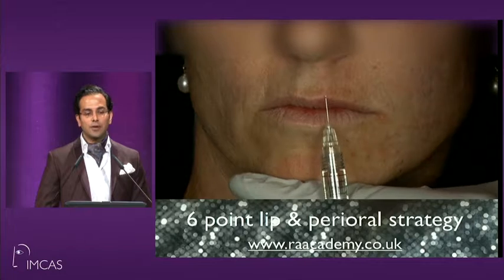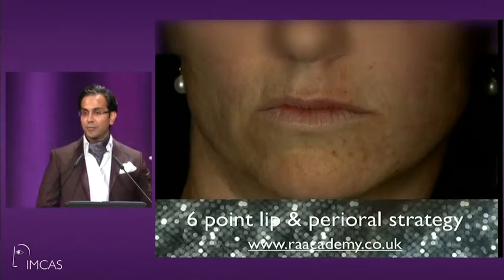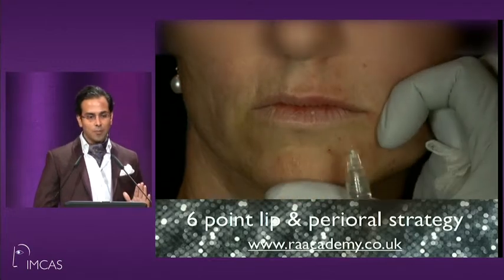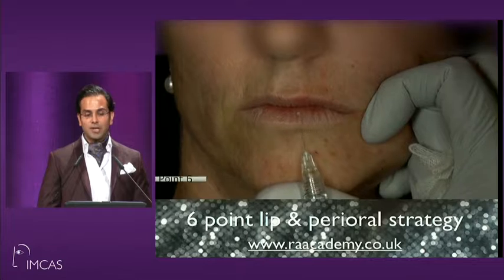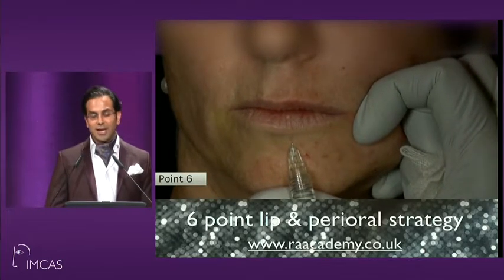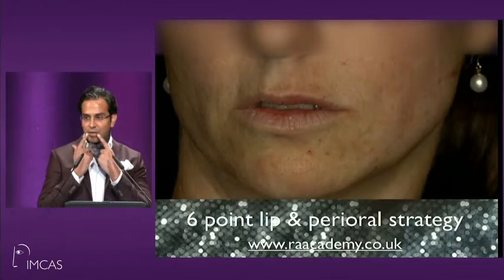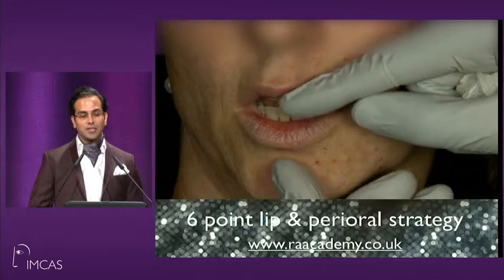Now let's have a look at the volumetry of the lower lip. So again, I'm going to use a cutaneous approach, so the reciprocal point for GK point in the lower lip, and this is where I'm going to wash the HA in behind the mucosa. But to save the patient the pain and also to minimize bruising, a cutaneous approach here, in behind the little dot of product, at the wet-dry junction, I make a bump. This is what a lot of beautiful women have, is the tubercle either side. And then I'll just mold and conform that to the tissue.